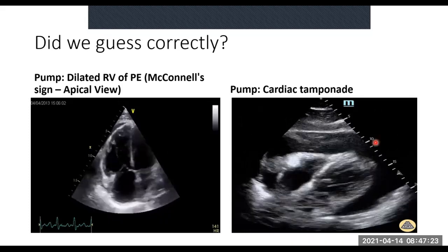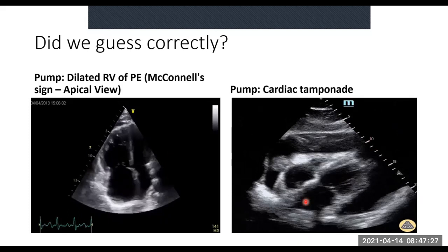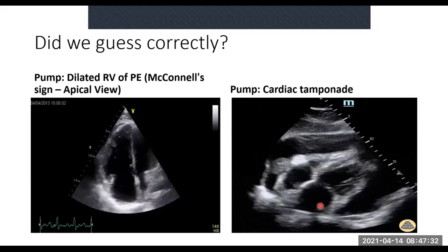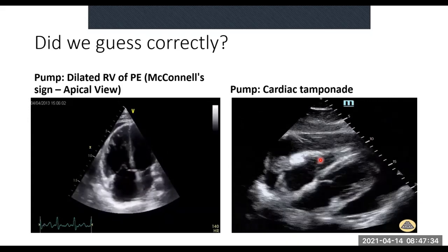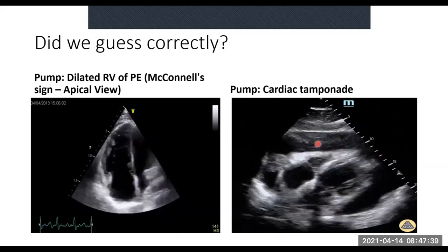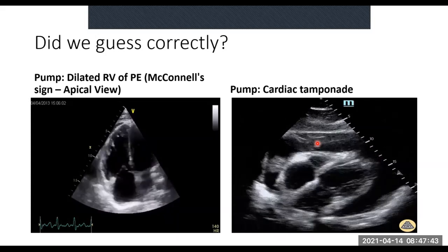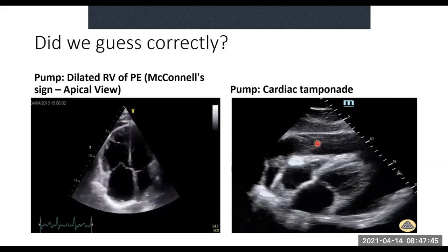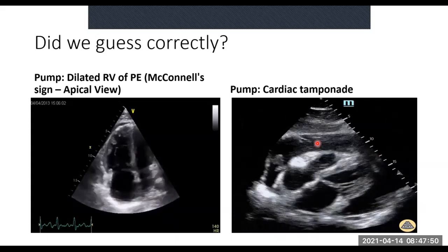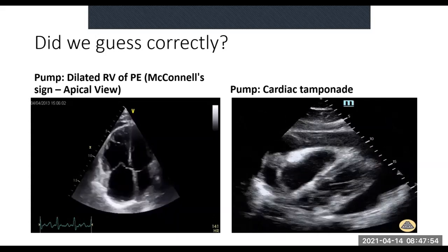And this is a cardiac tamponade, right? So this is seen from the subxiphoid view. So what do we notice? We've got the right ventricle, left atrium, right atrium. What's happening to that right ventricular wall? It's collapsing, all right, because there's so much pressure on it. So this is the type of tamponade that needs to be relieved urgently. That's the type of patient where you would try and do an aspiration. If it's liquid, get it to theater. If the patient has trauma, things like that. So these are the things that you look for in terms of cardiac tamponade.